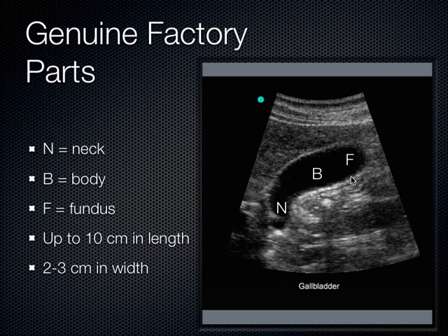Now, posterior to the gallbladder is what organ again? The duodenum. Specifically, we see here that usually it's the second portion of the duodenum, seen just behind the posterior gallbladder wall. And what's this right here? It's inside the lumen of the duodenum. Air. So air looks like this.